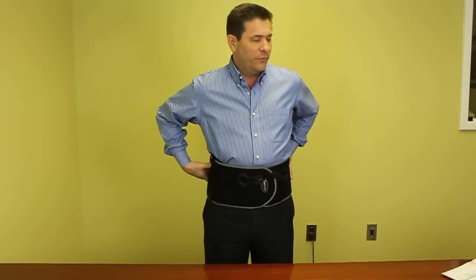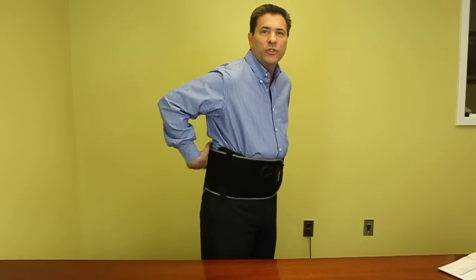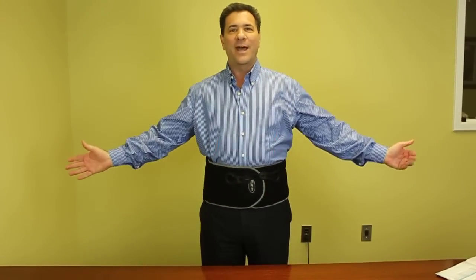Remember, this particular device, the Discovery 10, also has the complete support for the total upper back, but also has the removable back support so it could be just for the mid to lower back for the patient. This is the PDAC L0637, and there you have it.